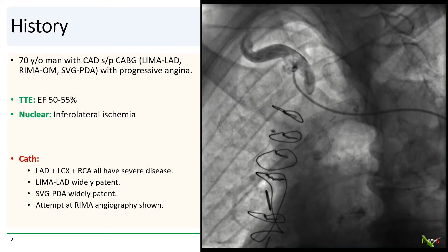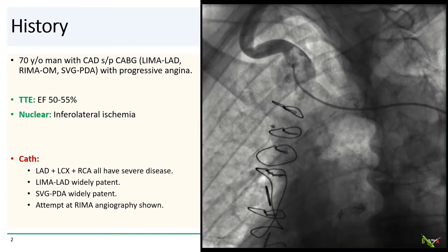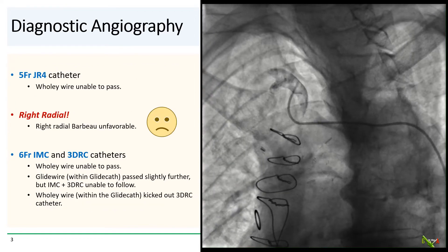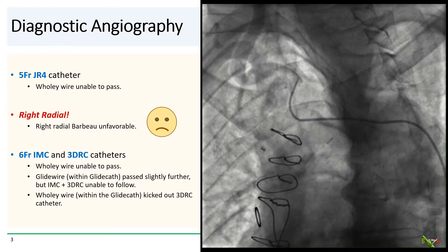You see a very tortuous right subclavian with a sharp downward takeoff from the brachiocephalic trunk. We tried to pass a Wholey wire through all this, but it could not make the turn into the subclavian.